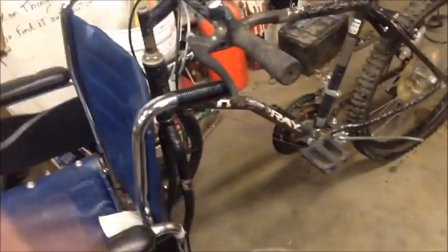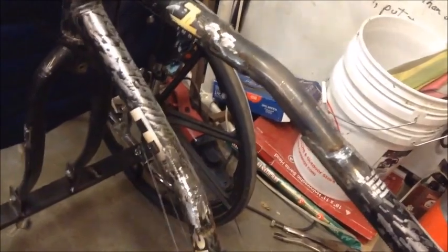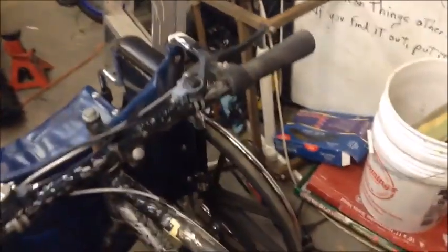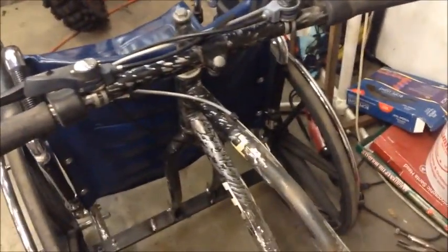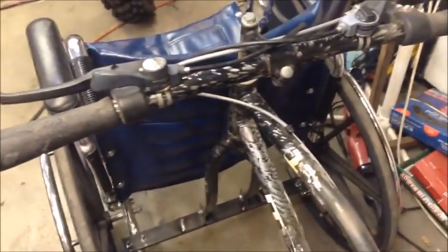But $20 secondhand bicycle and about an hour's worth of work. There's another close-up of the bracket down there. And, you know, about 3 inches of material added to the backbone. Notch the down tube. Off you go. It just doesn't take $1,500 to put something together to take someone in a wheelchair for a bicycle ride. Good luck, and forgive the messy garage. That wasn't the purpose.